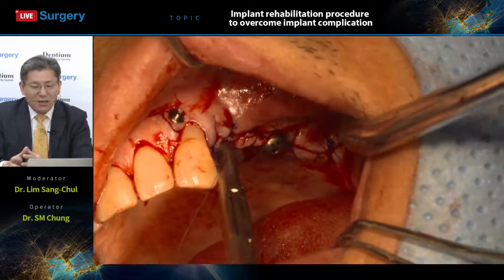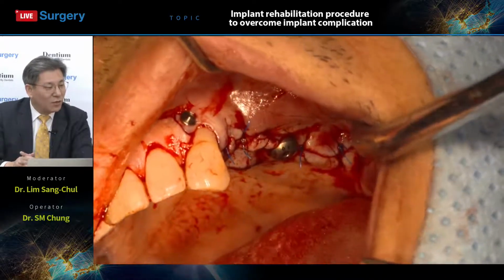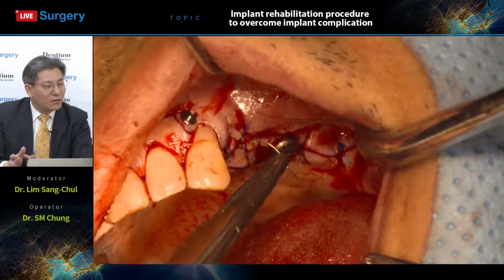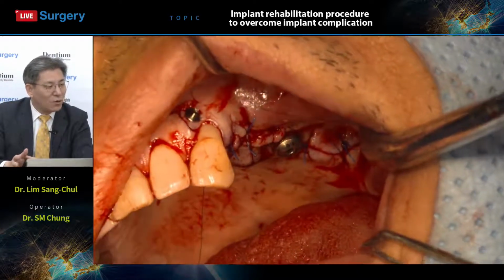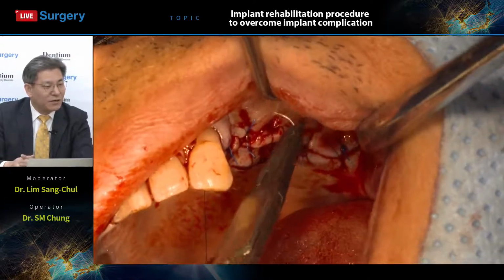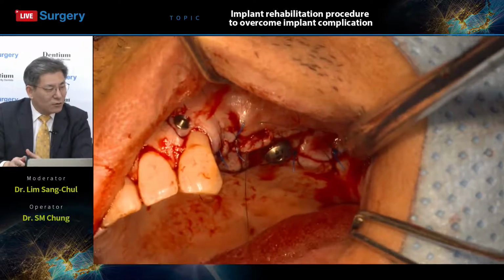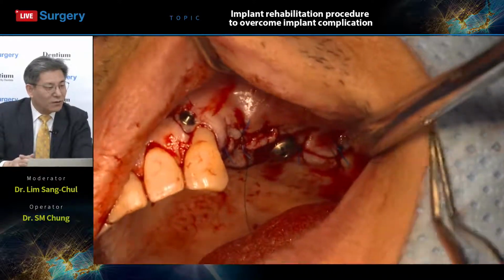It means usage of pin should be avoided on neighbor tooth root area or some implant installed area, right? It should be avoided. The pin should only be placed in the natural bone, right?